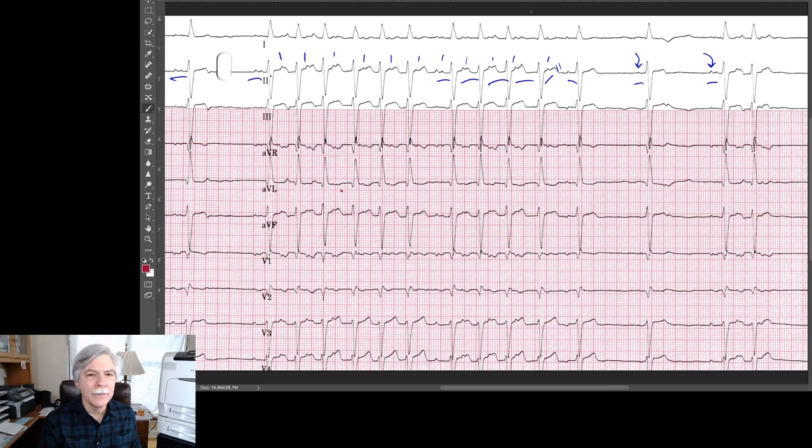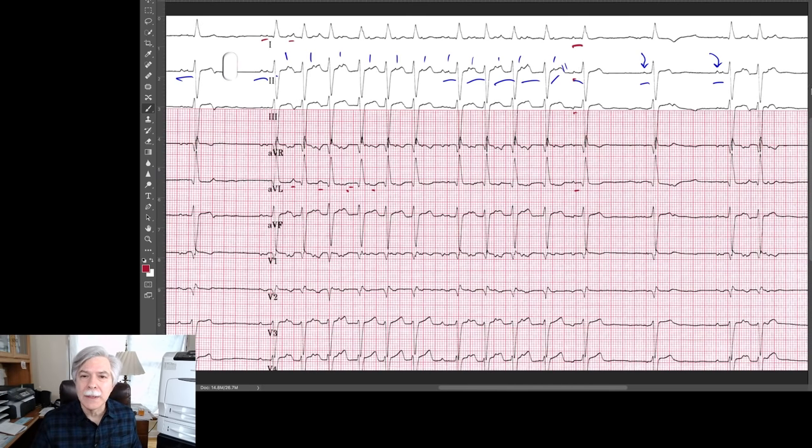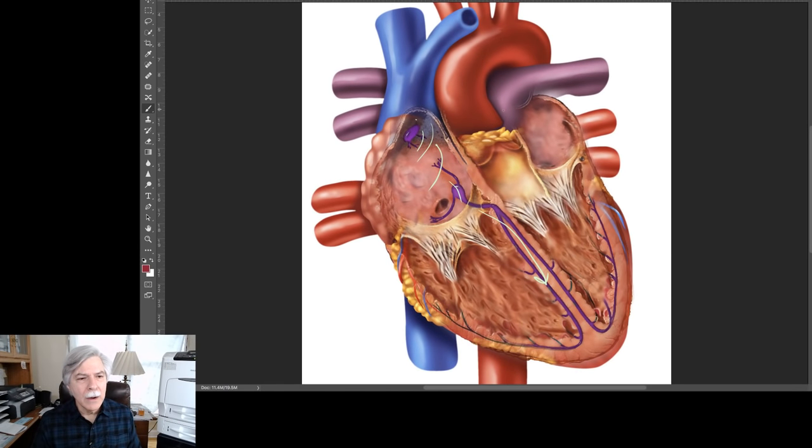So if this is a sinus beat, because it looks clearly different than all the others, it's up in one, but the ectopic focus is up in one as well. It's up in two, and it's sort of isoelectric in three here. It's up in AVL, and in this case, the tachycardia is up in AVL. So the axis is very similar. It's heading down towards the feet and kind of towards the patient's left. And when you look at V1 and even V4, V5, V6, the P waves during tachycardia were very similar, but a little different because they had this double bump. Okay. So when we go back to the heart, the internal view here, where could this be coming from?